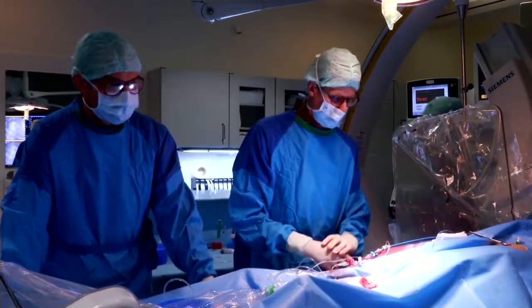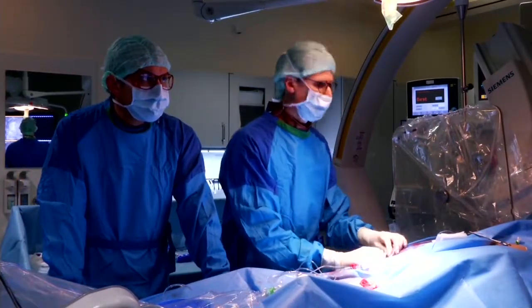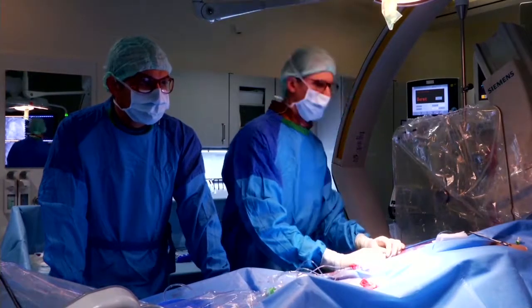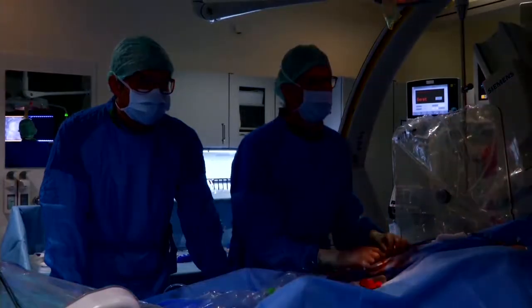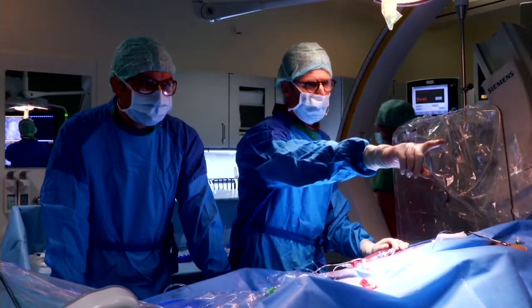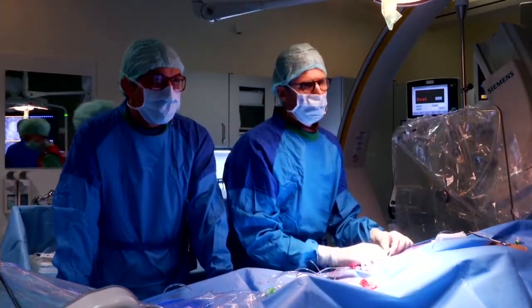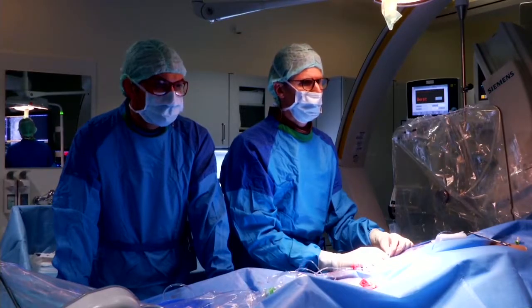Right, there are quite a lot of possibilities to do the pullback. So now we're going to see the pullback. Okay, now I think we proceed with the pullback, and then we can discuss perhaps a little bit further. So we now need the camera on the pressure, so we have to turn it. This is a little bit handmade, everything, but it works.